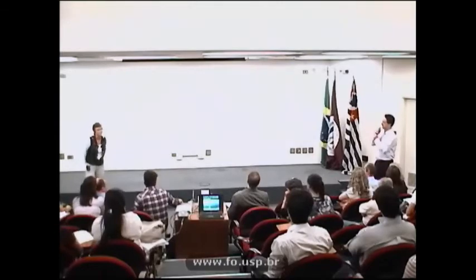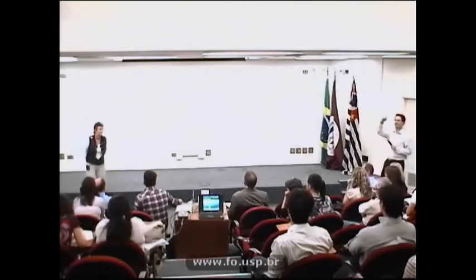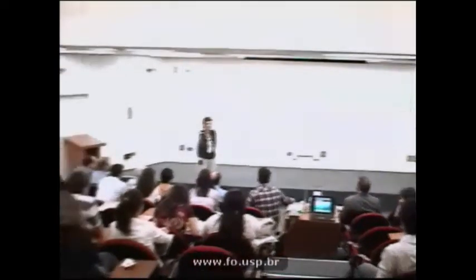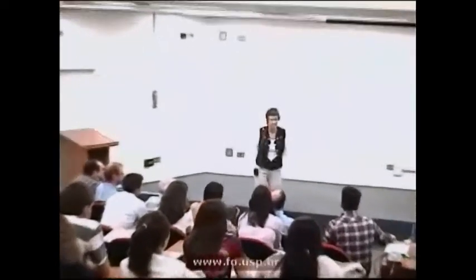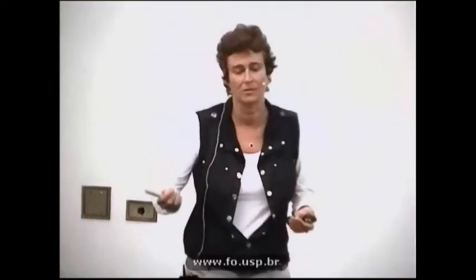Okay. First of all, I will only work with a very good, upper-level laboratory that is not counting the hours of work. Second, I'll make sure that he knows how to treat the material, how to work with it, and how to combine the veneering ceramic with the zirconia. How often do they use materials with the wrong coefficient of thermal expansion because they prefer that veneering ceramic versus that one, and they're not all compatible.